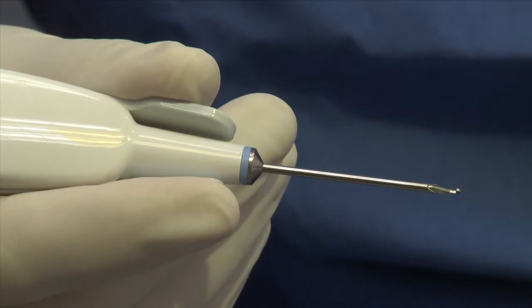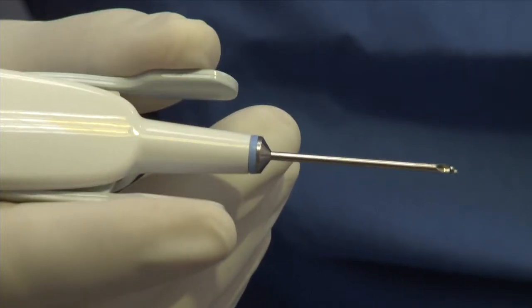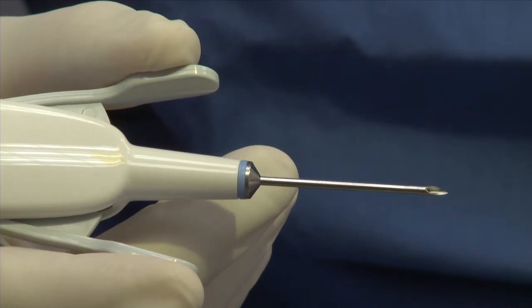The needle is advanced under the skin in a horizontal fashion. Once in appropriate position, the handpiece is actuated and the hook is exposed from the needle. The operator is then able to remove or disrupt a section of vein by retracting the device.